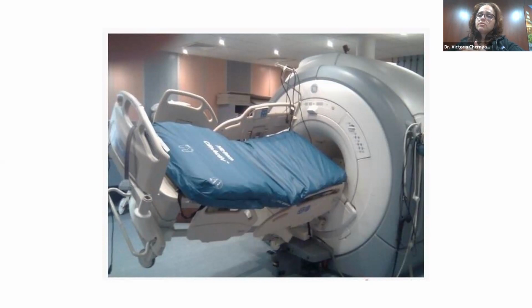And you can imagine that this is a very dangerous thing, because if the patient is in the bore and something flies right into it, it can damage the patient pretty badly. So safety instructions must be followed very carefully. If you ever go down to the MR scanner as part of the clinical team, don't think that people are being mean to you. We're just being very careful and really are concerned about your safety.